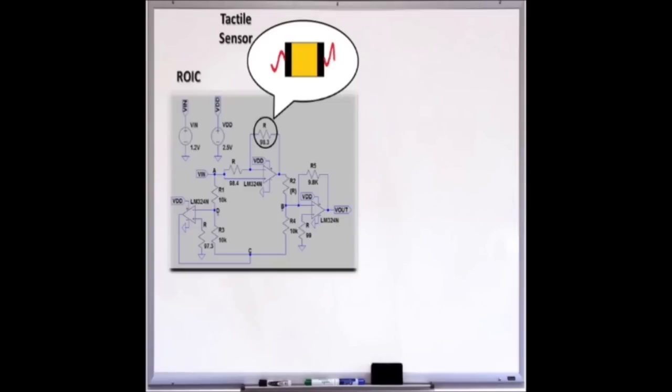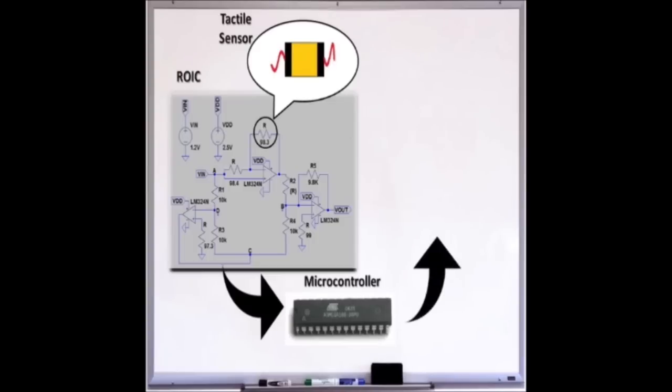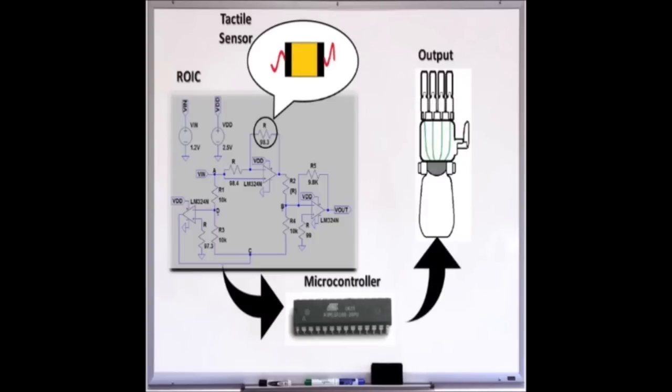The circuitry is connected to a microcontroller, which is then connected to the 3D printed arm that has already been implemented with electronics. The arm then reacts according to the microcontroller.